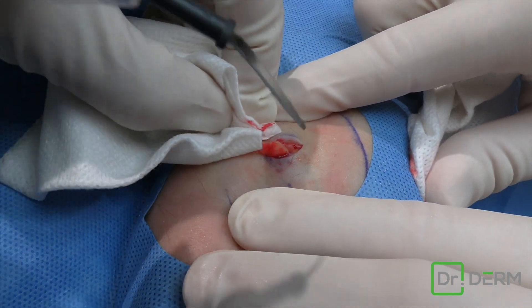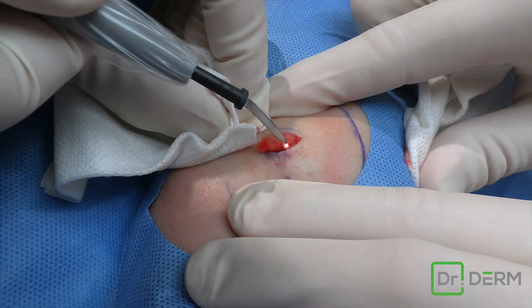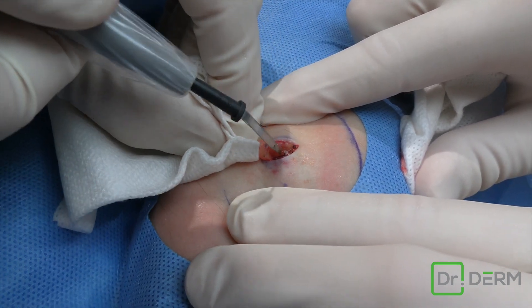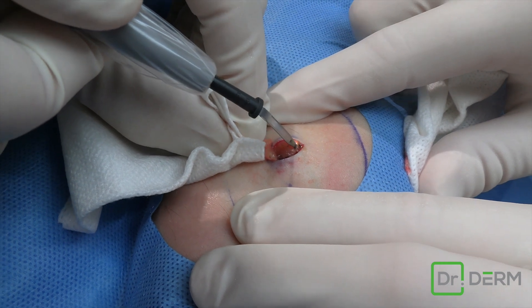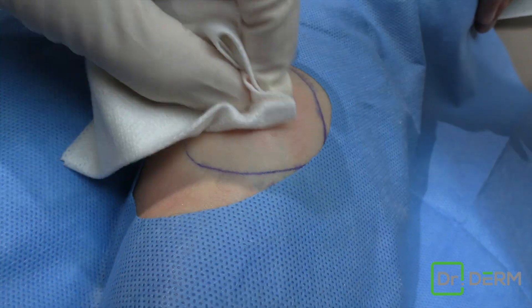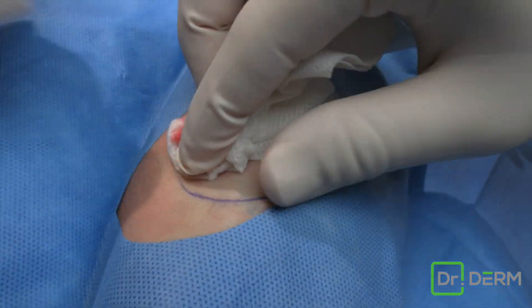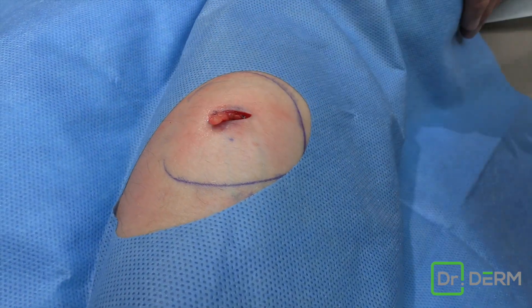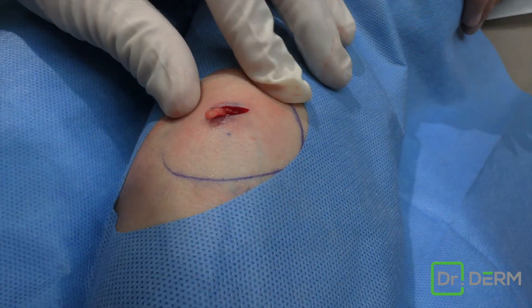Doesn't that feel like the 24 bomb that's gonna go off? Yeah, I'm like wait a minute. Okay, so there's a little electrocautery — you won't feel it but you'll hear it. Okay, let's see how this guy wants to do. We should have a couple in there, so we'll see.